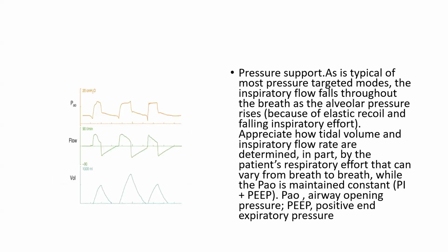Now this is the schematic representation of pressure support. As is typical of most pressure targeted modes, the inspiratory flow falls throughout the breath as alveolar pressure rises. And appreciate how tidal volume and inspiratory flow are determined in part by the patient's respiratory effort, which can vary from breath to breath, while the opening pressure is maintained constant.